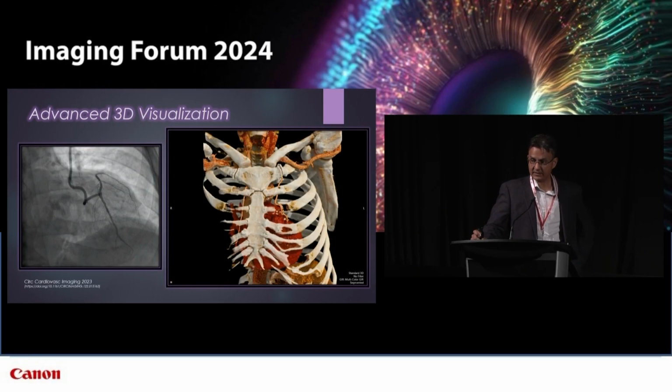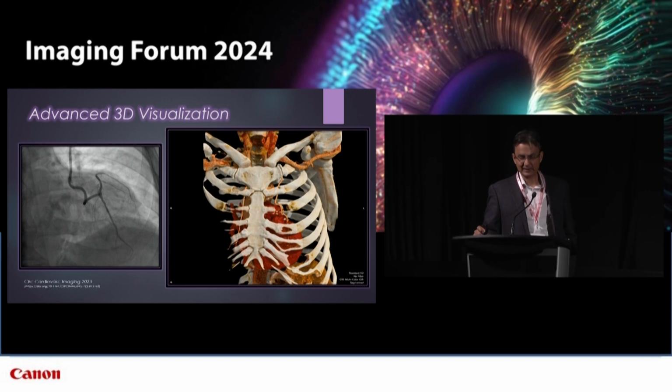This is a case that I published with our surgical colleagues, a fascinating case. So the image on the left is just a 2D planar conventional cath, selective injection of the left internal thoracic artery. This is a patient who 20 years earlier had undergone CABG, single vessel CABG, and not just any single vessel CABG, robotic CABG, something that our center happens to do or has been doing for over 20 years.